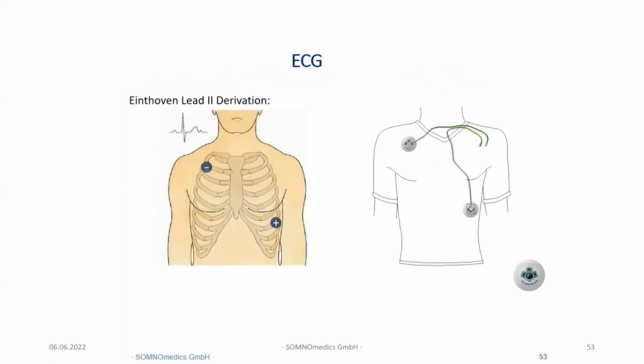Similarly, as I told you, a 2-lead ECG is good enough, because we are doing a polysomnography and not a 12-lead ECG; in polysomnography we have to have a lot of sensors anyway. The second lead ECG is most important because it will give you bradycardias as well as tachycardias, asystole or anything else, for example atrial fibrillation. It will pick up the most, and that is why the second lead ECG is recommended by AASM.